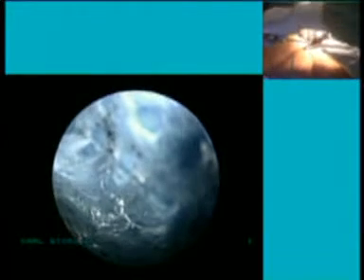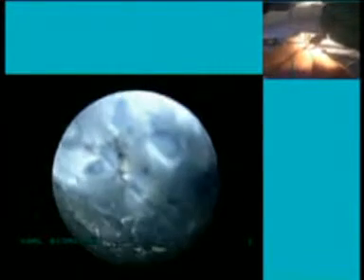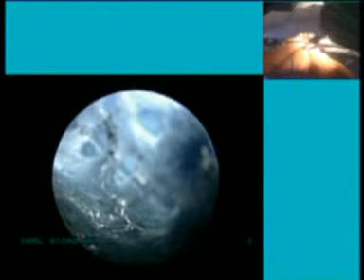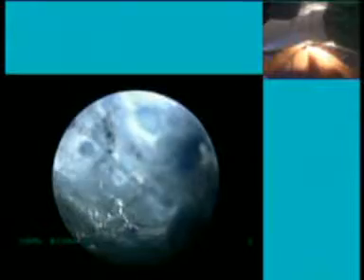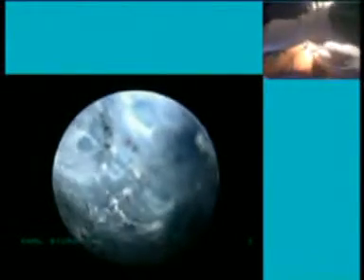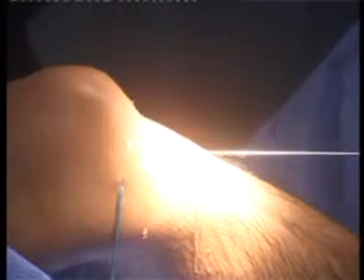We do it through the pre-op MRI measurements of the footprint. Study on the Indian population also. And we always keep 14 mm as the minimal. Still, 14 to 16 mm is the gray zone. And 17 is the minimum. 17 is the minimum I do double bundle reconstruction. For the femur as well as for the tibia? As well as the tibia. So your radiologist is able to tell you the footprint size? Yes, we can measure. You're a very good radiologist. Because we have only musculoskeletal radiologists. Well, we'd be lucky if our radiologist tells if the ACL is torn or not.